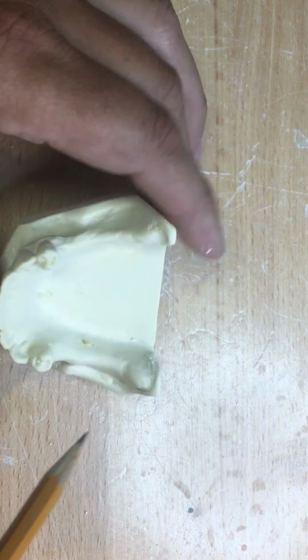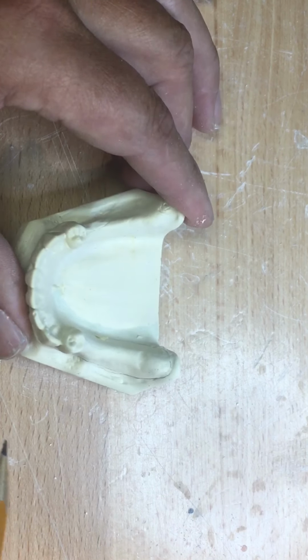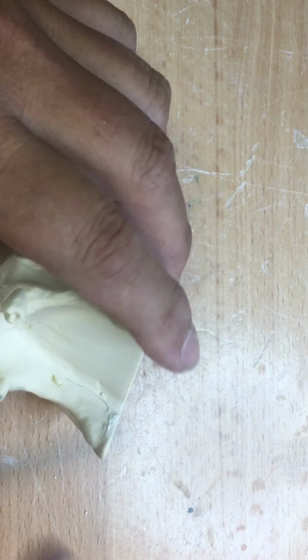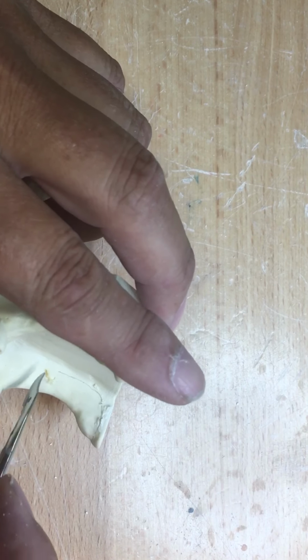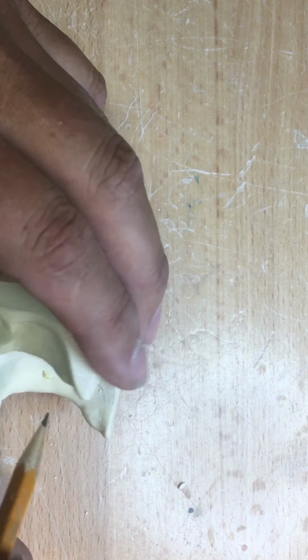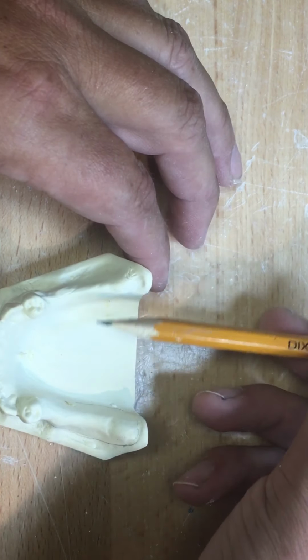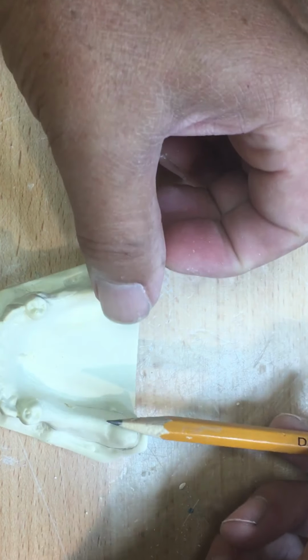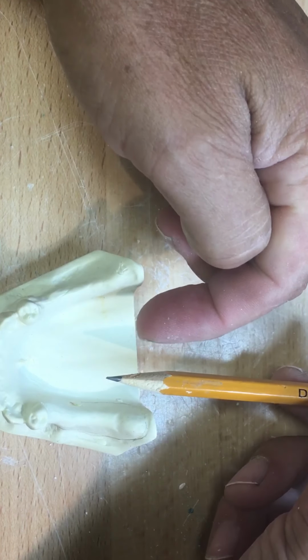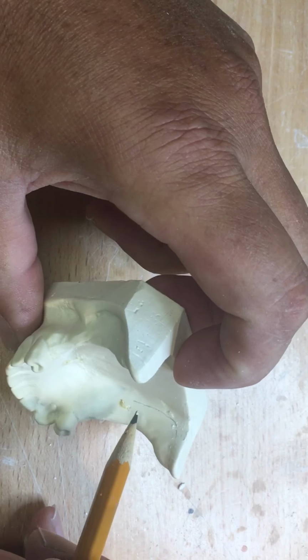This is a base plate, extensions of the posterior section. Now, this is not the finished denture, but I'd like the bite registration or the occlusion rim to have the same extensions as the full denture. Therefore, another reason why this occlusion rim is used for, not just for those registrations, but also patient expectation on the extension and the size of the denture. When the client loses their posterior teeth, the tongue will fall into the neutral zone here. Then when the denture is introduced, the tongue will be constricted. Now, if we don't constrict that during the treatment phase, it's a big surprise on insertion day.